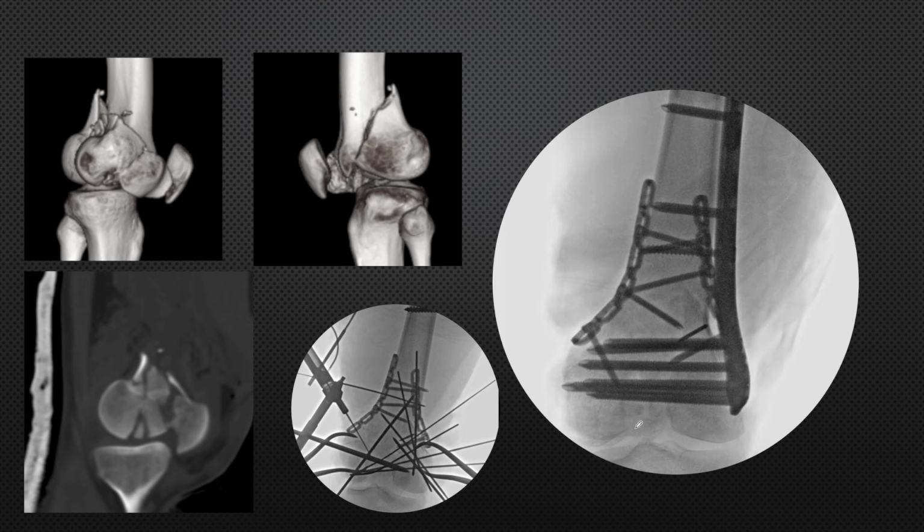The medial side is extensively comminuted, but the problem is what implant to be used. So it is kind of a proximal tibia fracture which has extensive comminution and multiple depressed fragments. So we need a kind of raft construct that will be able to support all these fragments in line. So we want a screw somewhere here, a screw somewhere here, and a screw somewhere here, and as multiple screws are placed, it will be good.